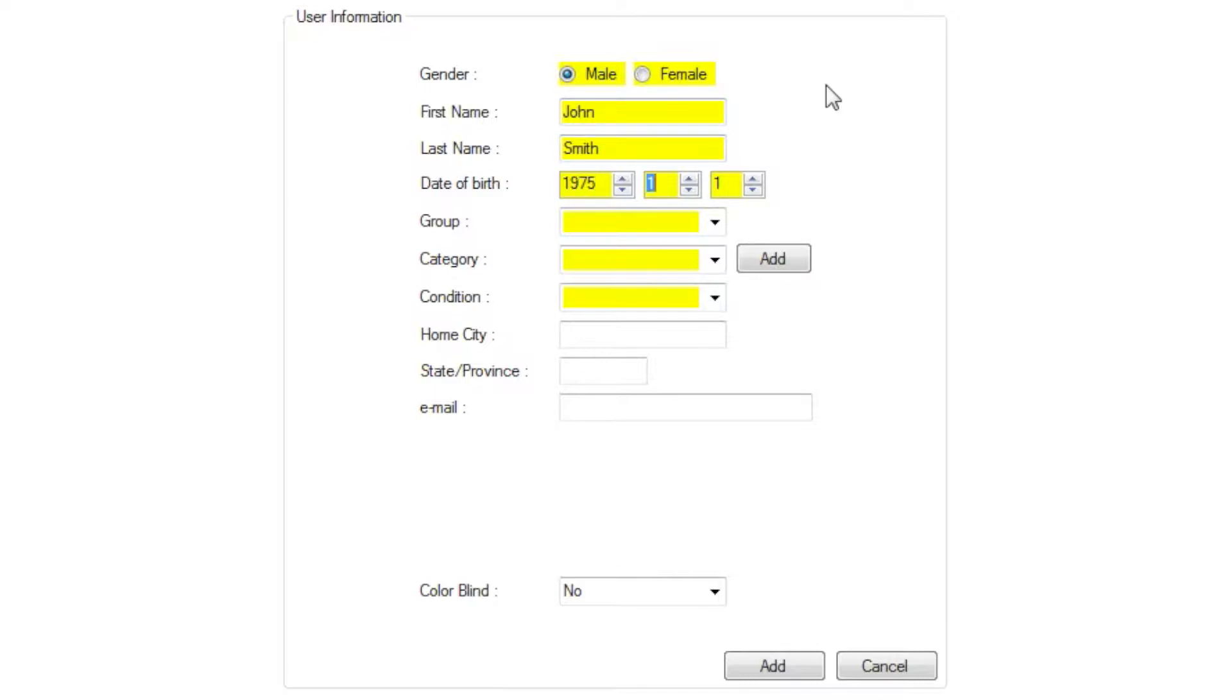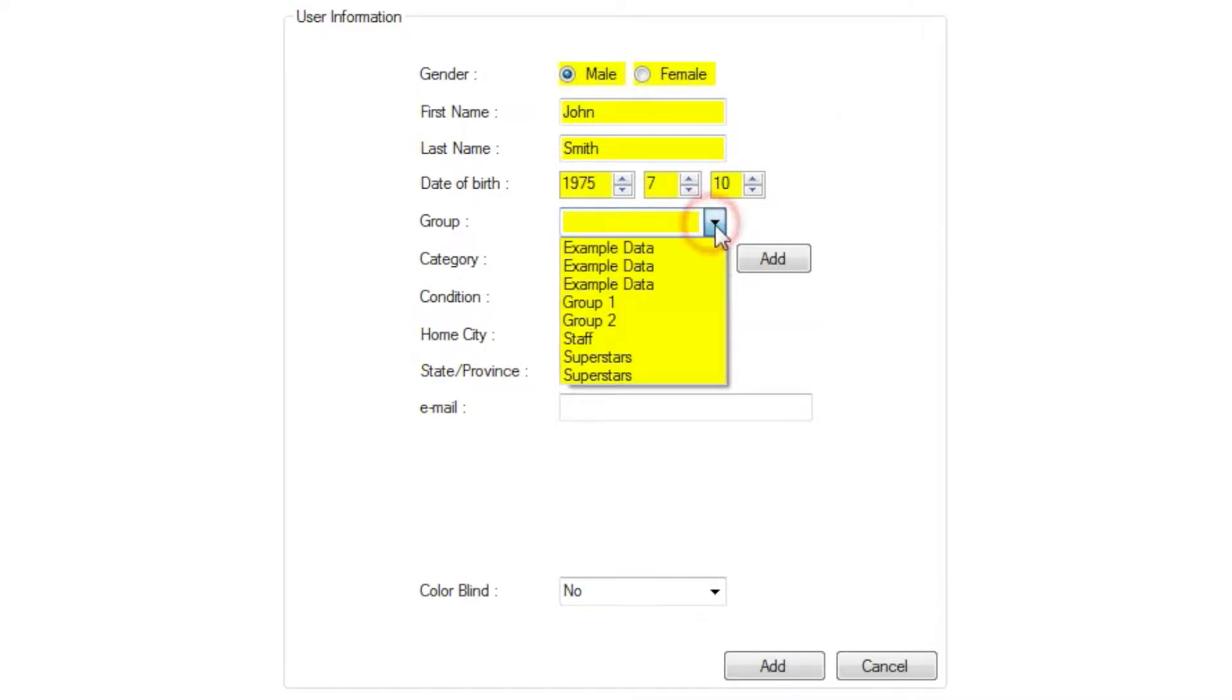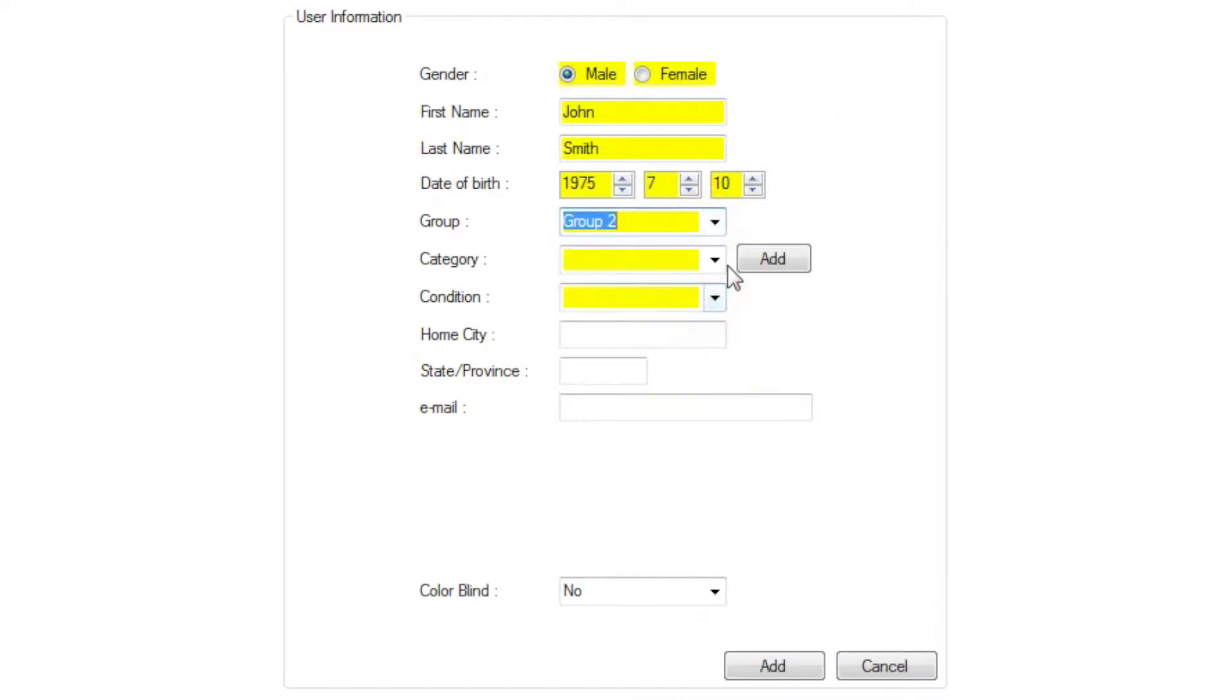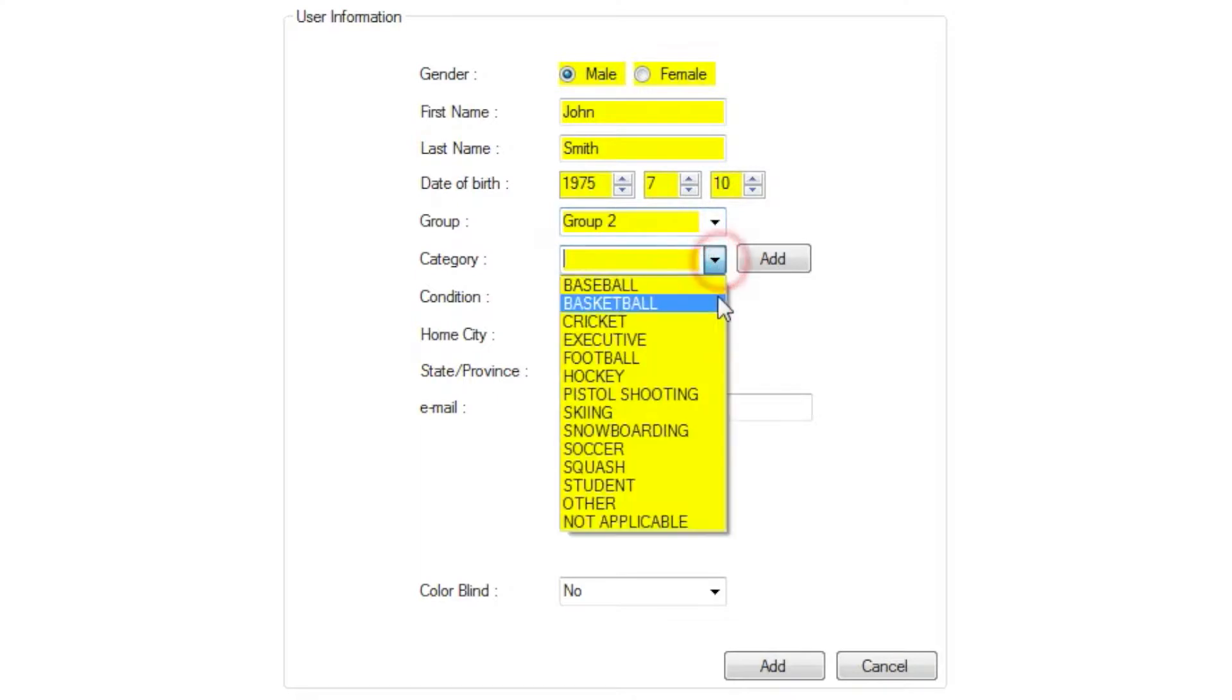Choose a group to place the user in. Groups are how you organize users within Neurotracker. Next, choose a category you want to associate with your user. If you don't see one that applies, you can type a custom category into the box and click Add. It will be saved for this user and can be applied to future users.